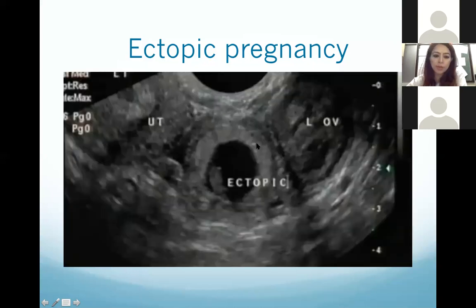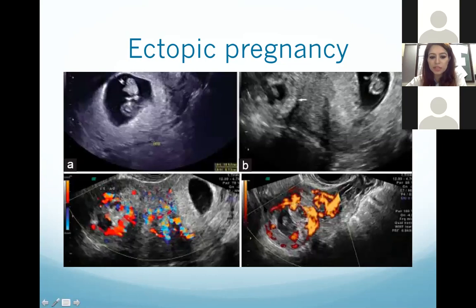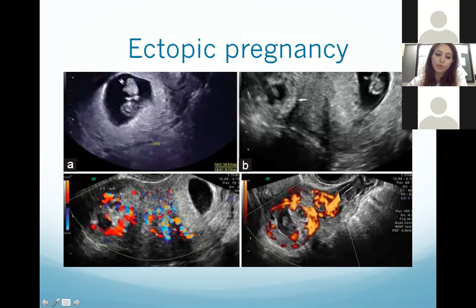This is another case of ectopic pregnancy. Here you can see the uterus and the left ovary, and between them a thick tubal ring-shaped structure with a fetal pole — this is likely a tubal ectopic pregnancy. A typical sign is the ring-of-fire appearance: on Doppler, extensive vascularity is seen all around this tubular structure. This is also a hallmark for diagnosing ectopic pregnancy even when there is no fetal pole inside.